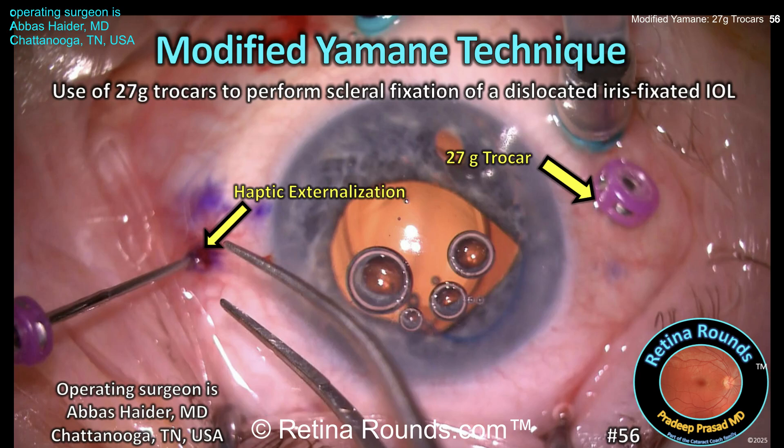Retina Rounds episode number 56: Modified Yamane Technique Using 27 Gauge Trocars. Guest surgeon Dr. Abbas Haider from Chattanooga, Tennessee rescues a dislocated iris-fixated three-piece IOL. In this case, 27-gauge trocars instead of needles are used to perform a modified flanged intrascleral haptic fixation. Thank you Dr. Haider for your contribution, and let's check it out.